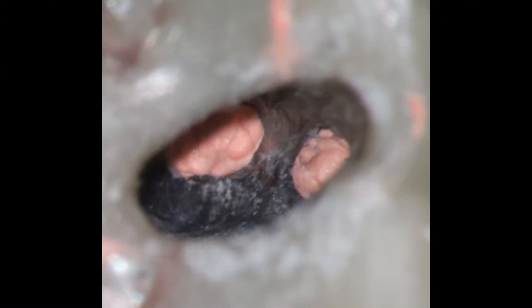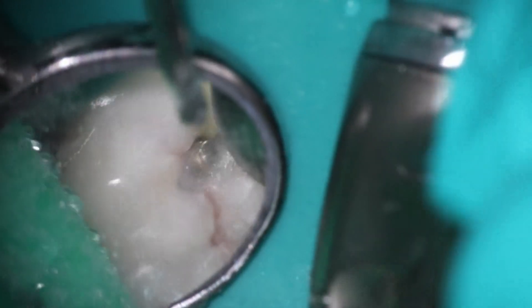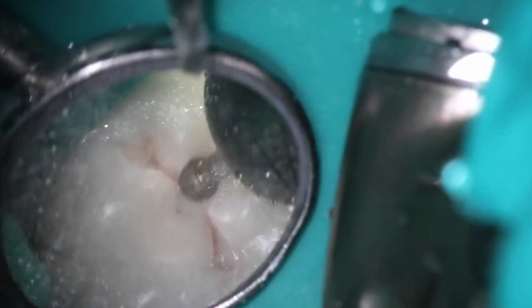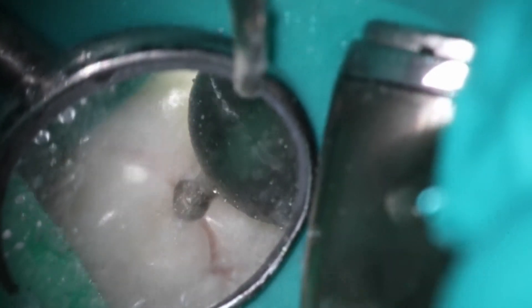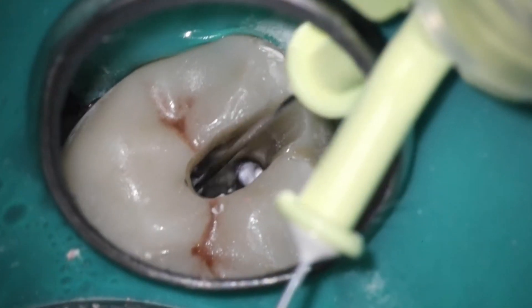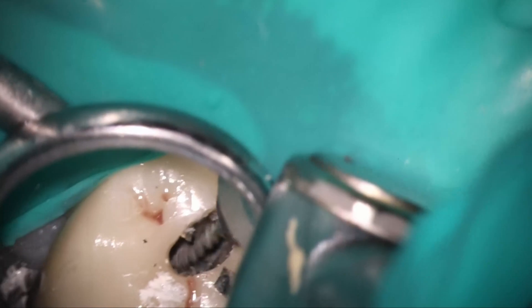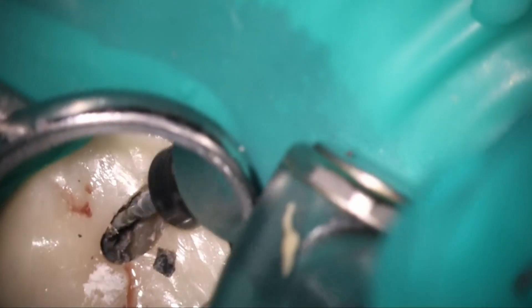Packing everything down — in this case the dentist likes to see these patients back to the fills. I'm just happy that he's sending patients four hours away for me to work on — that's fantastic. Hopefully that was a useful case on how to look at zirconia in a different way, address it differently, and how to deal with calcified canals. That pro tip: if you're struggling and getting frustrated, take a break, place calcium hydroxide. Oftentimes you'll be pleasantly surprised — you'll see the calcium hydroxide come right back up the other canal, showing you that you have a type II system. And then sometimes it works out great and you can drop a 2006 right back down.